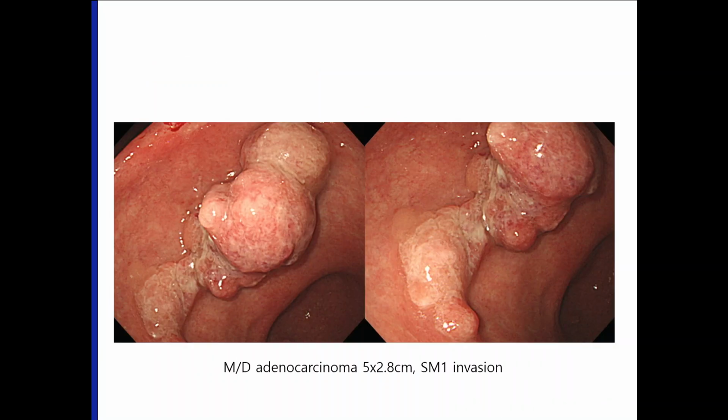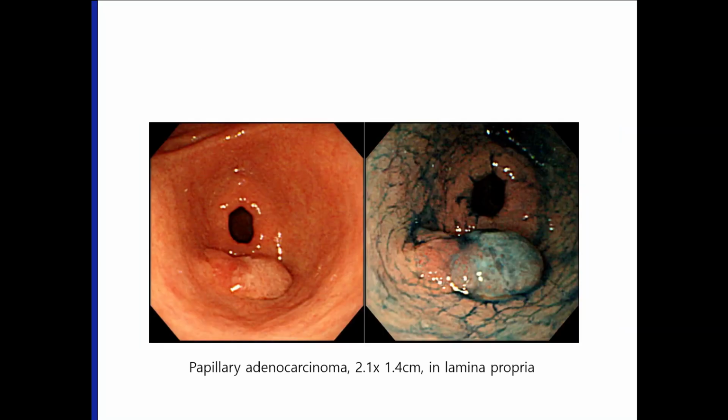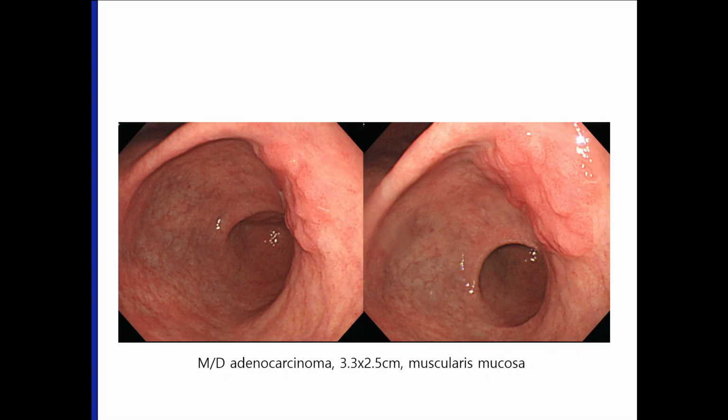What do you think? This is an EGC type 1. What's your opinion? This is also EGC type 1. What about this case? My opinion is EGC 2A. Okay, you can say 2A plus 2C. But in the classification, the simpler, the better.